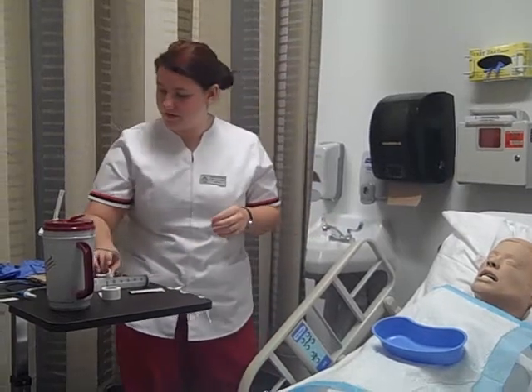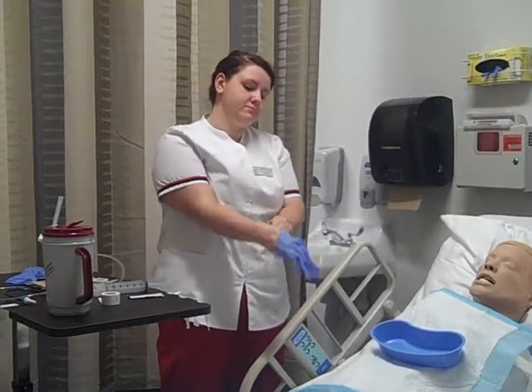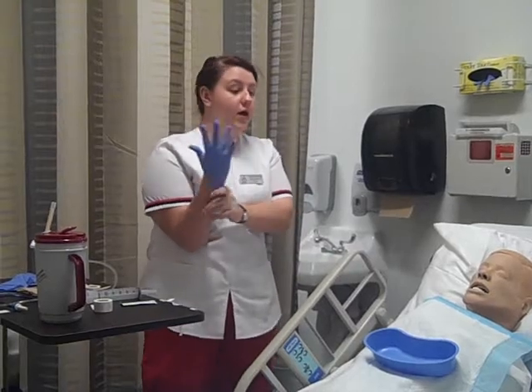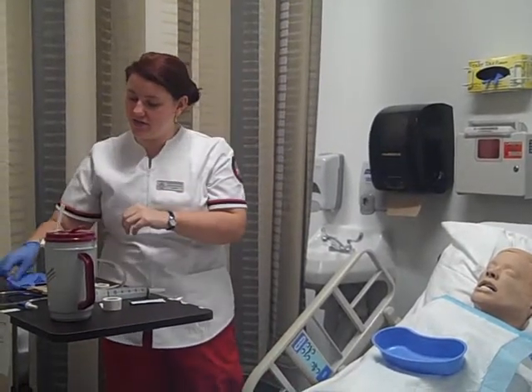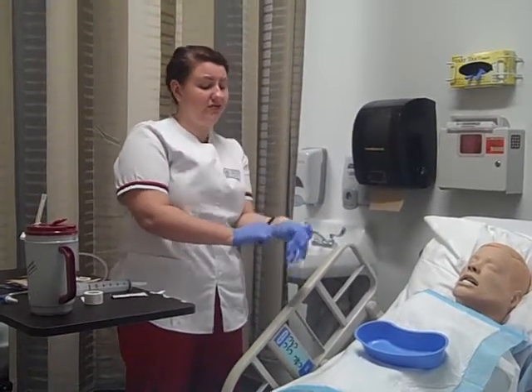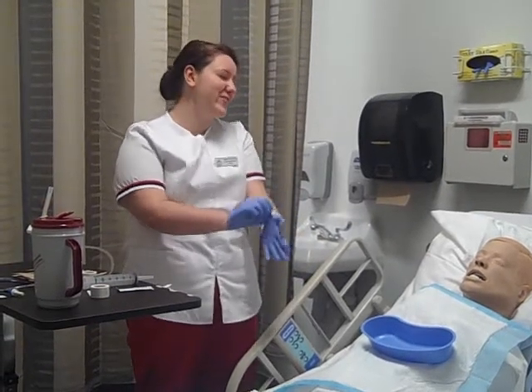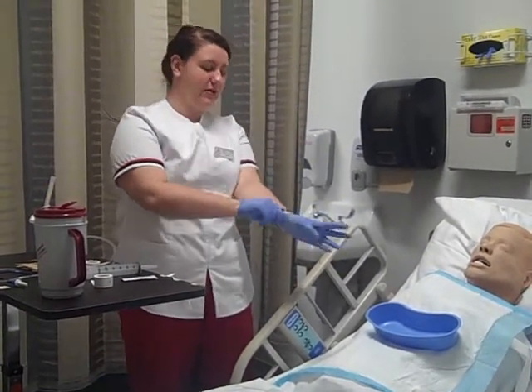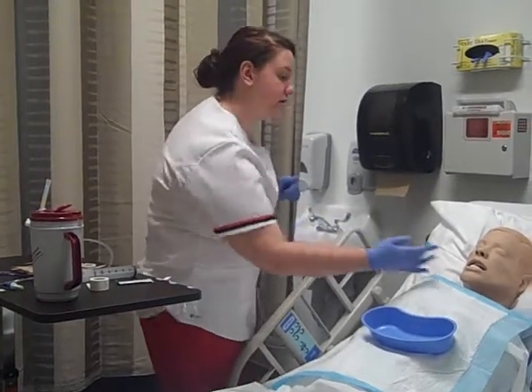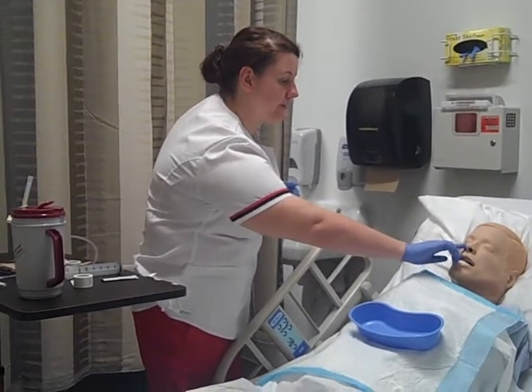Okay, there we go. And I'm going to put on my gloves. Miss Amy, before we get started with the NG tube, have you ever had any NG tubes before? Okay, you haven't. Have you ever broken your nose? No? Okay, well before we get started, I need to determine which nostril I'm going to use. Can you blow for me? Thank you. And can you blow again? Thank you. Okay, I'm going to use your right nostril.